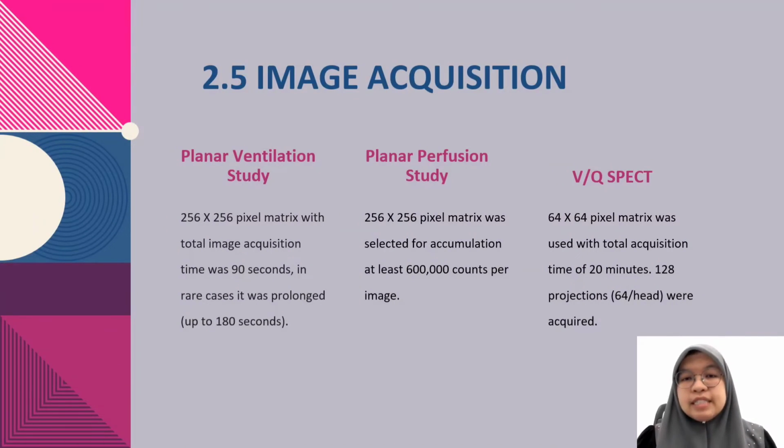And the last one is VQ SPECT. A 64 by 64 pixel matrix was used with a total acquisition time of 20 minutes.